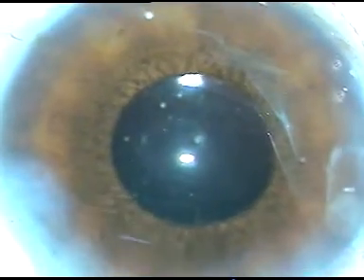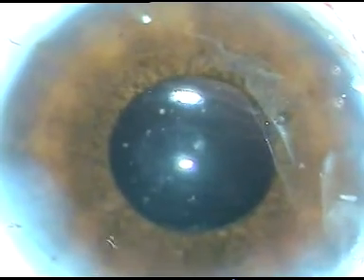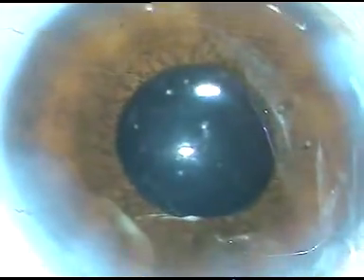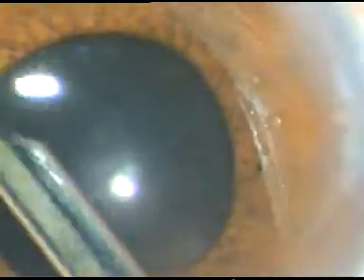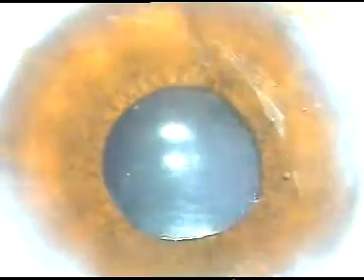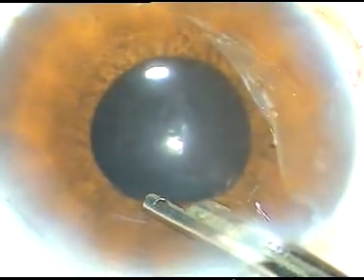Now I hydrate the side ports. I always make a final wash to clean out the viscoelastic substance that may remain, and I do it at higher magnification. I also clean the viscoelastic that sticks to the corneal endothelium. Then I form the anterior chamber and conclude the case. Hope this video will help you in developing your surgical skills. Thank you for your attention.